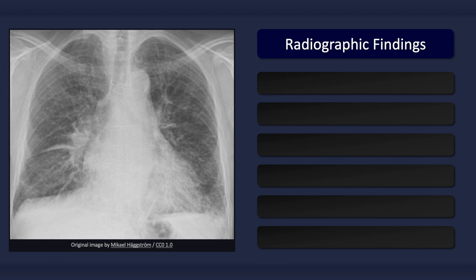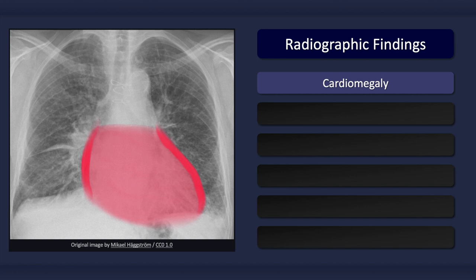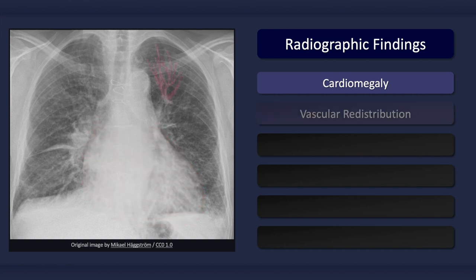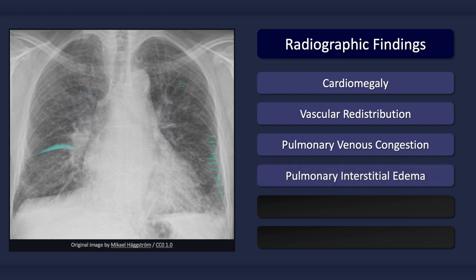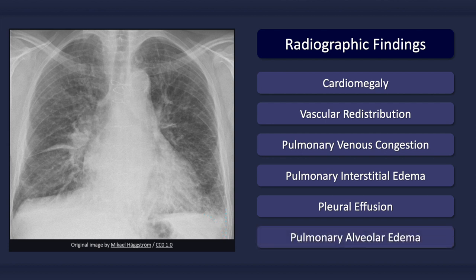On an erect posterior-anterior chest x-ray, suggestive findings include: cardiomegaly, which does not necessarily need to be present; vascular redistribution, that is, the cephalization of blood flow; pulmonary venous congestion; pulmonary interstitial edema; pleural effusions; and in more severe disease, alveolar edema, which is not clearly evident on this radiograph.